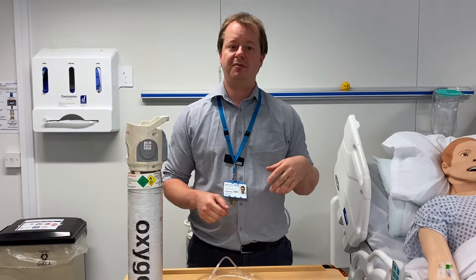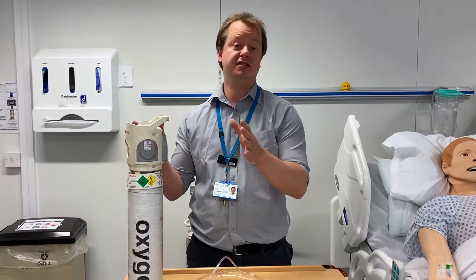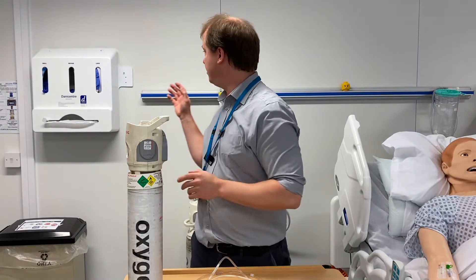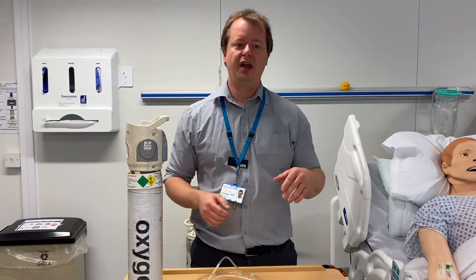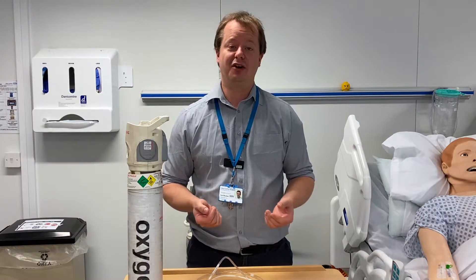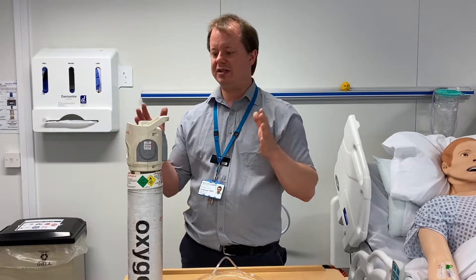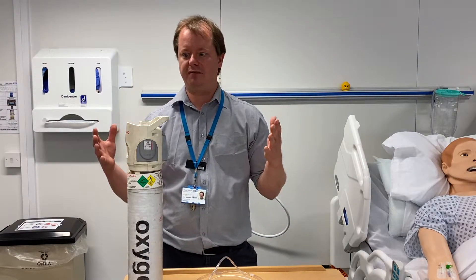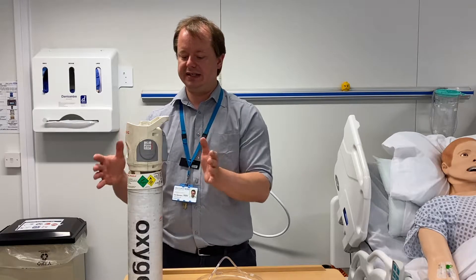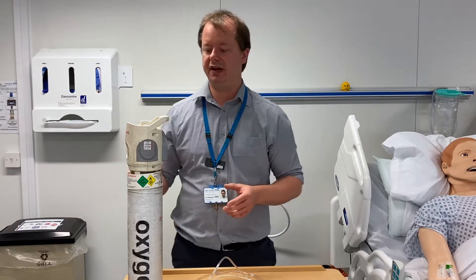Hello everyone. I'm going to do a short video on some of the containers of oxygen, whether that be the cylinders or the wall oxygen. So when you're in Westerfield Hospital there are two ways which you will be able to get oxygen to your patients: either cylinders or ward oxygen. We'll talk about cylinders first.